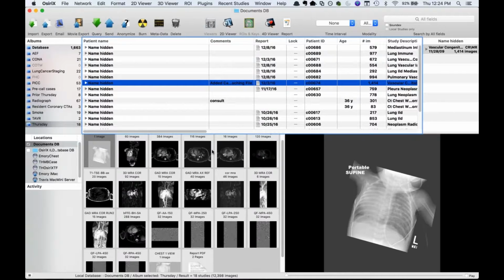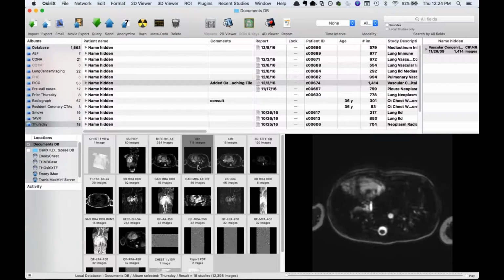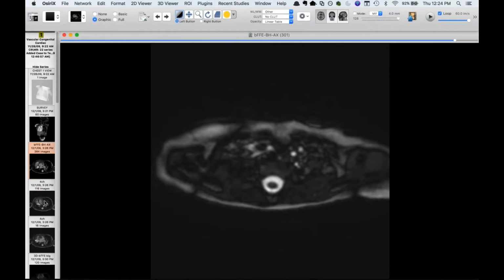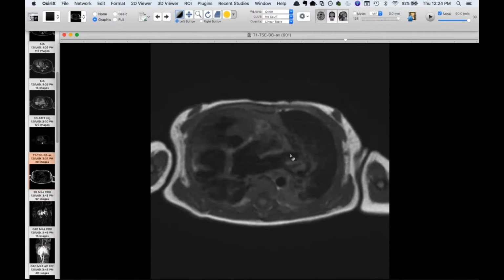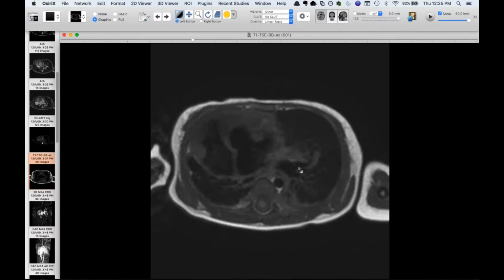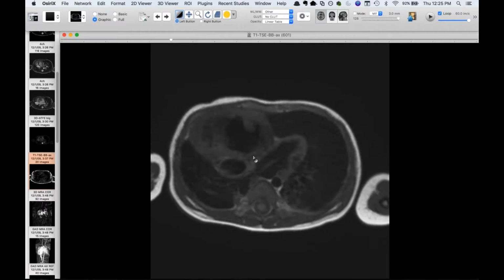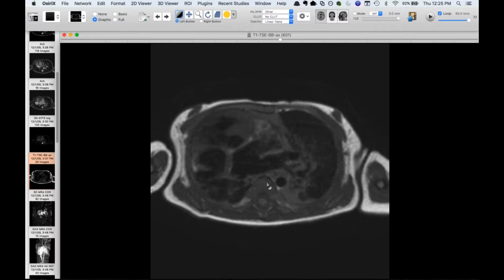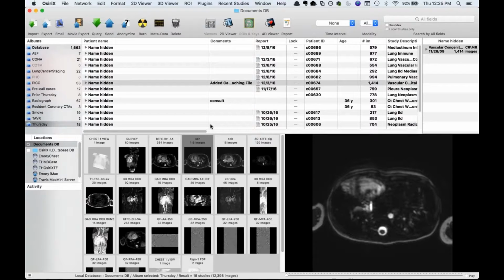This one was only an MR, but you can see on the black blood images, if I find them. I don't even know where they are now. Here, you can see very similar, same thing. I think you can see that projection there. This patient actually had a VSD as well associated with their scimitar. But I just wanted to show those really quick just because it's one of the rarer associations, and we'll call it pseudo scimitar or pseudo horseshoe from now on. So, all right, Jeff, I'll stop there just since there's others. I can do more later.